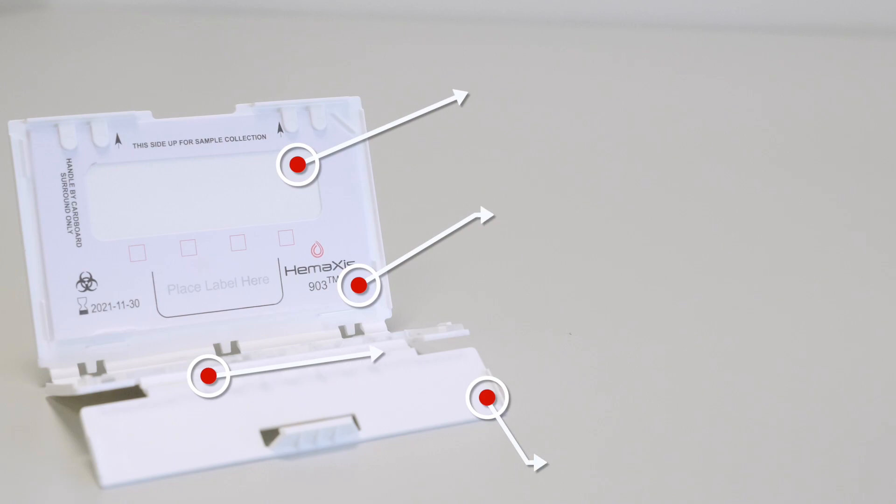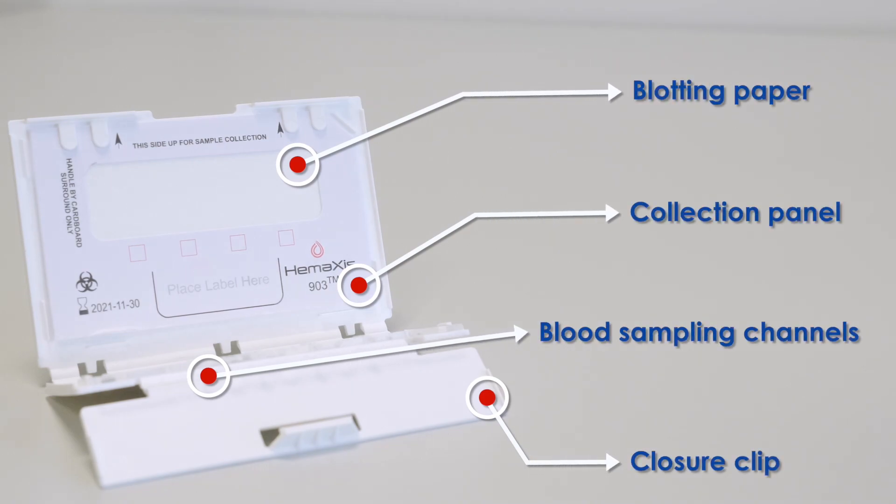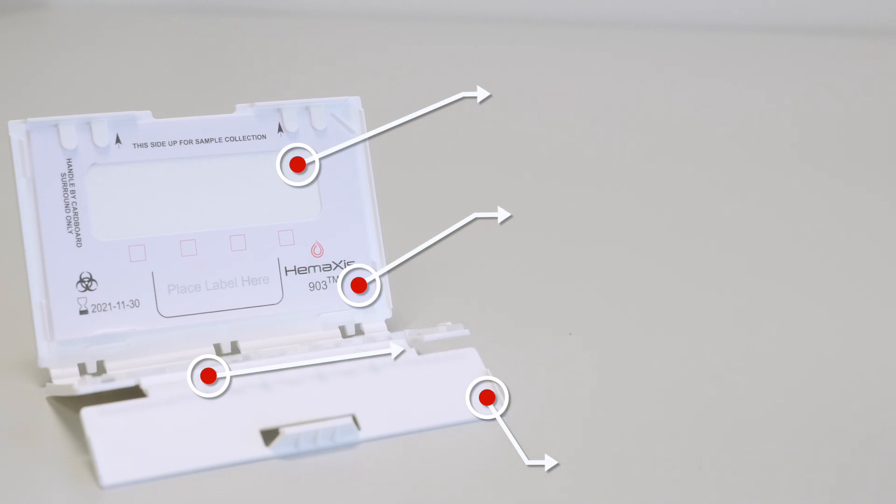The DBS kit comprises the following parts: a blotting paper, a collection panel, blood sampling channels, and a closure clip.